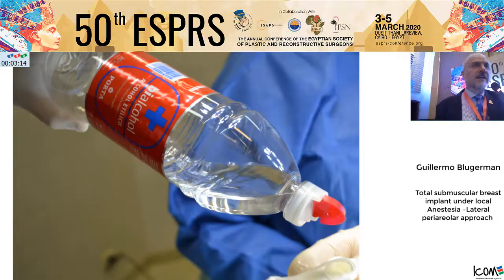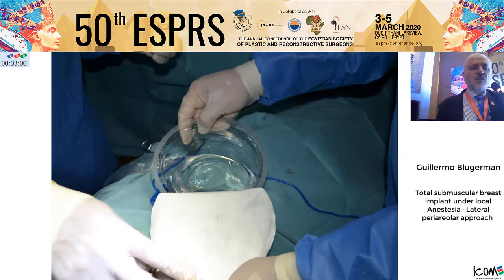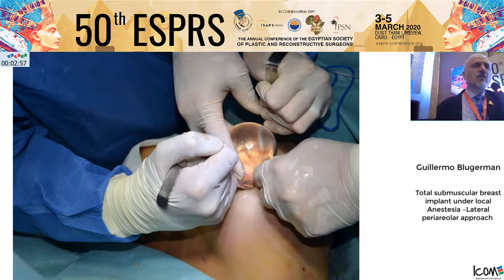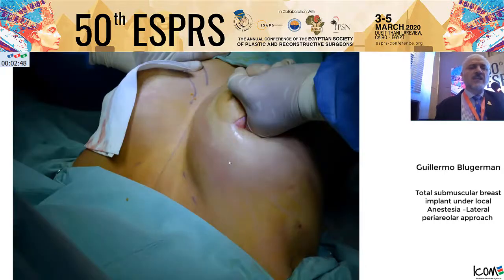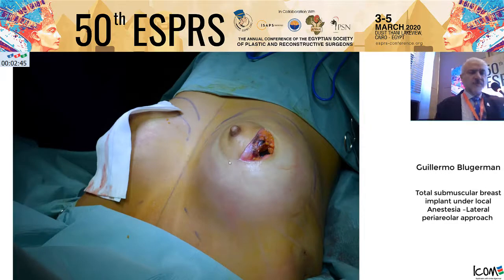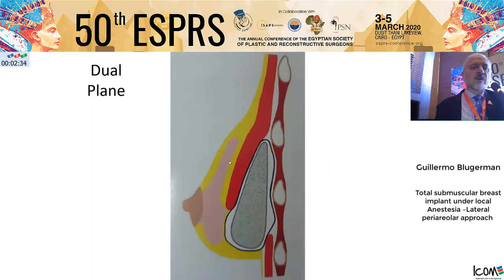Now we open the implant. We disinfect the skin again with alcohol, which has a very effective short-time disinfection effect. With the Keller funnel or with the hands, we introduce the smooth surface implant. We have used smooth surface implants for 40 years now with a very low rate of capsular contraction in the subpectoral pocket. We then do revision of the implant pocket and finally close the muscle.